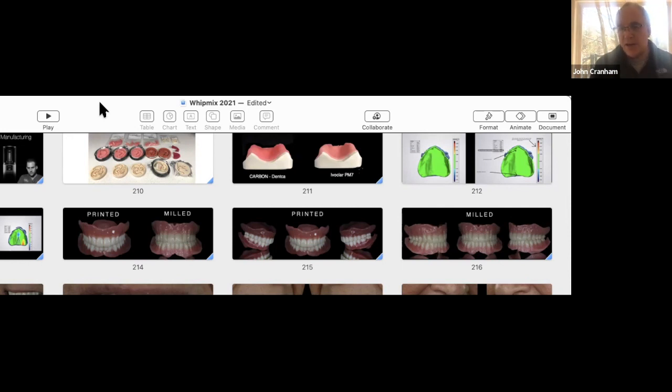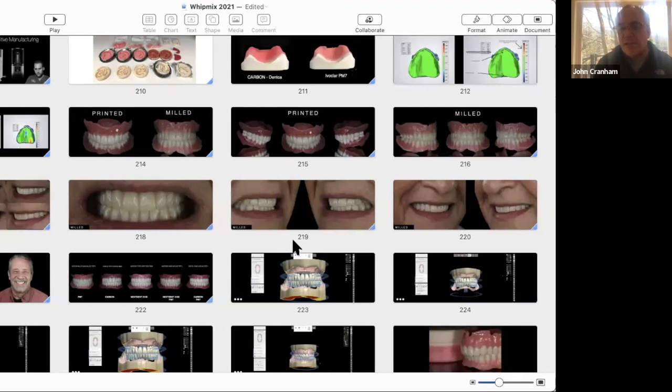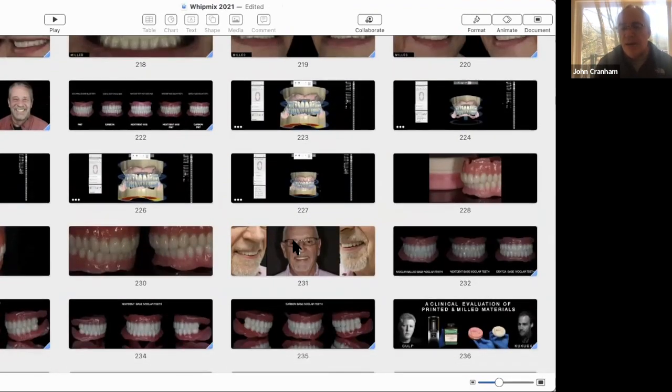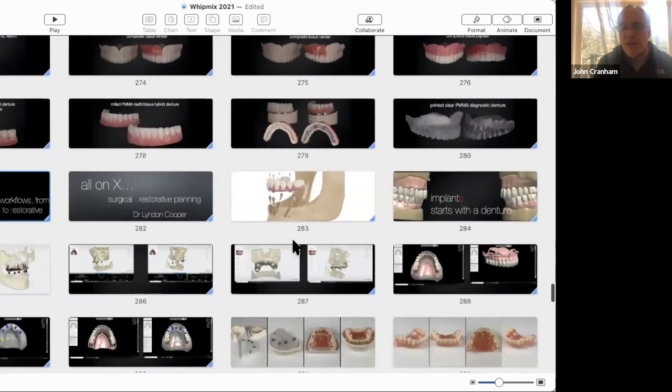I mean, if you have a terabyte or 2 terabyte hard drive, it's going to take a really long time for us as a dentist to fill that up, because the scans and the design work that we do are not very big. And if you start bringing in CTs and all that stuff, it's one of the reasons that I haven't really gone to doing my own implant stuff. The implant studio is expensive, but when you start pulling in CBCTs, that starts to be bigger.